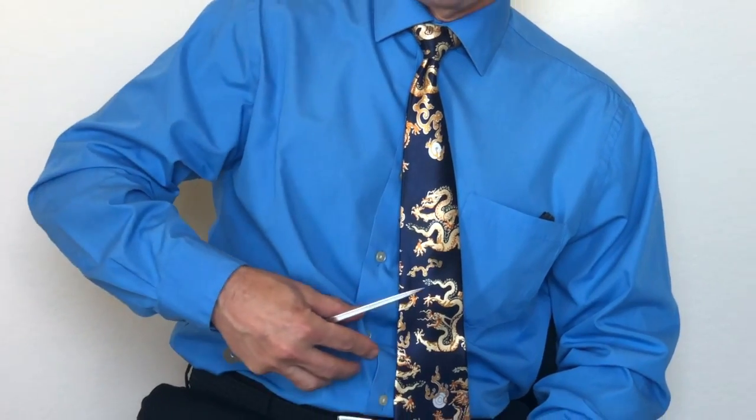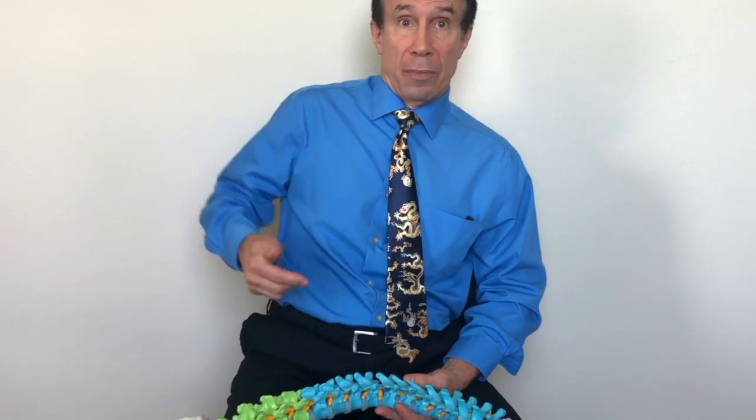The whole thing is then sewn shut, and the patient is given a device that is held in the hand. It resembles a computer mouse that is placed over the generator, and the patient can then use the device to turn on and off the stimulator in order to gain control over his or her pain.